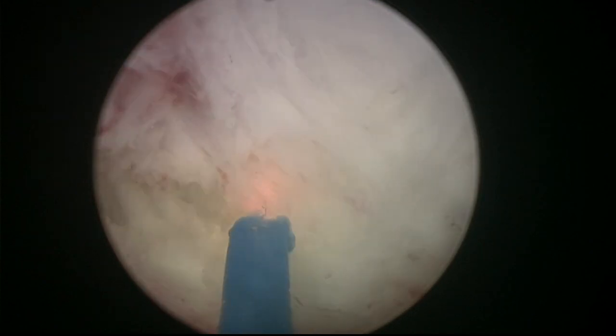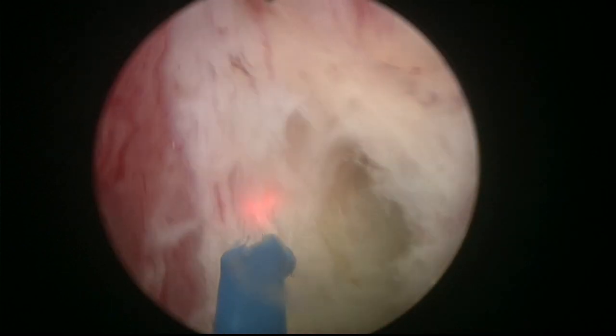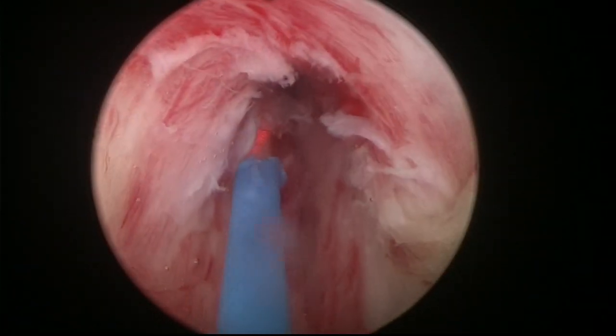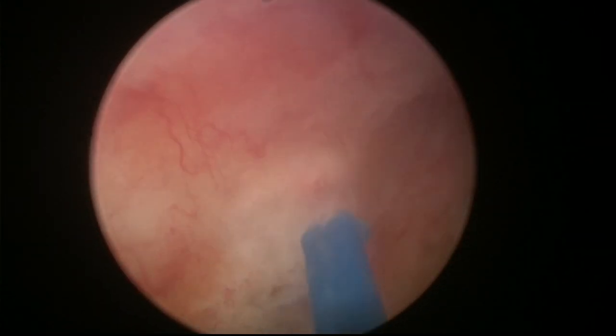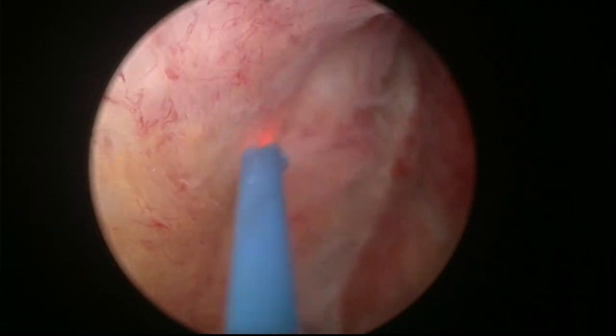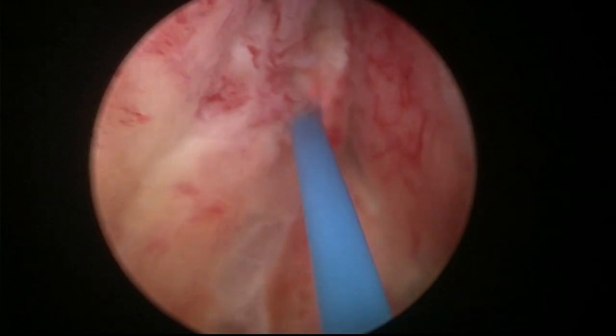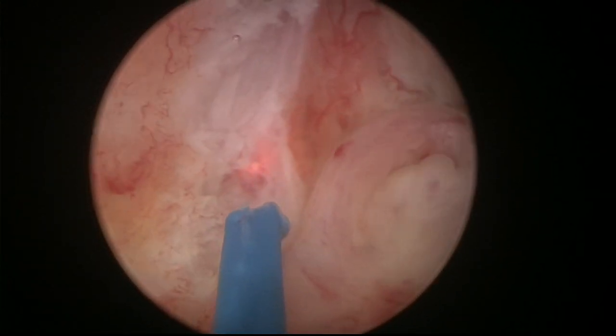You don't want to get lost, so you want to mark this white line all around the sphincter, down to the apical area — you'll see how helpful it is later for the apical dissection. What I am trying to achieve is protection of the mucosa of the sphincter. I want to protect it. I don't want to be far away from the sphincter; I want to be relatively close, but one or two millimetres is not such a relevant difference.